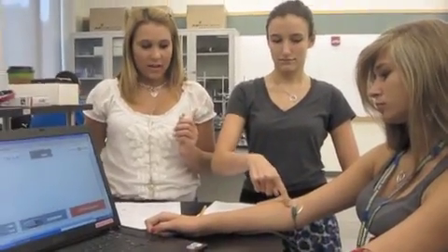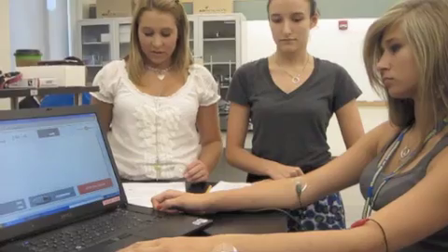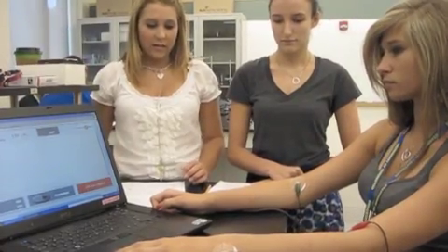We will be placing 3 electrode tabs, one on the right, one on the left, and then a neutral on the bone. Then we will be placing the red positive on the left, the green negative, and then the neutral black.